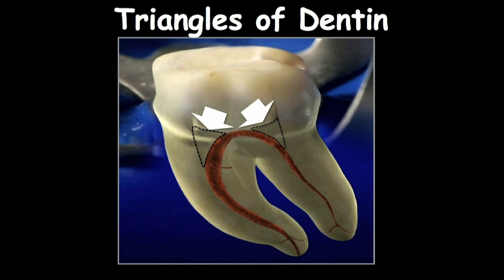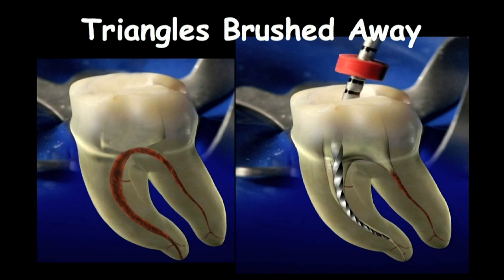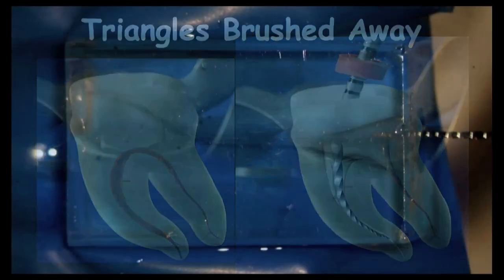The buccolingual is where the ferrule is essential, and the triangles, of course, are mesiodistal essentially. You can remove these triangles with rotary instrumentation. An excellent instrument would be, for example, SX. You could also use X1, but the big thing is the concept of removing these triangles before you say, okay, it's time to follow to the end zone.